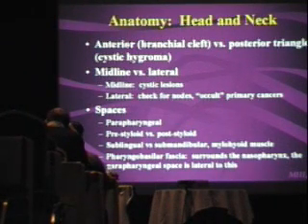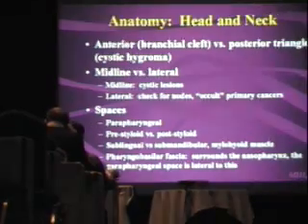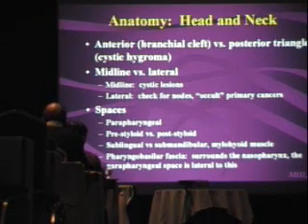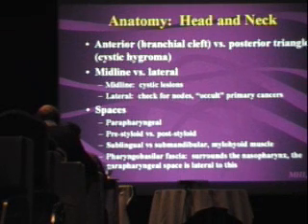One of the other things to keep in mind is that in true clinical practice, unlike things like board exams, most of the time the clinicians are either going to know or have a pretty good idea of what the lesion is. So it's not so much about listing an exhaustive differential diagnosis. What head and neck physicians, otolaryngologists, want to know is how to guide their surgery. What stage of disease is this? Are bones invaded? Is cartilage invaded? How should I plan my surgical approach? Those are the type of concepts you should keep in mind as we go through these things.